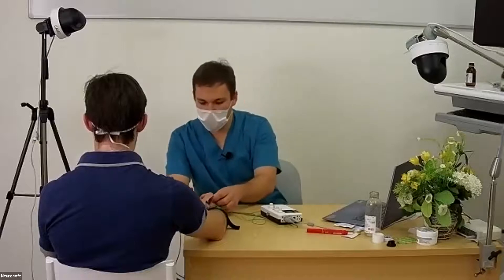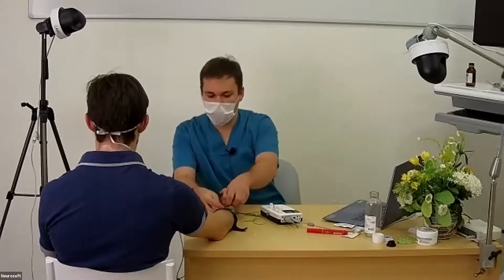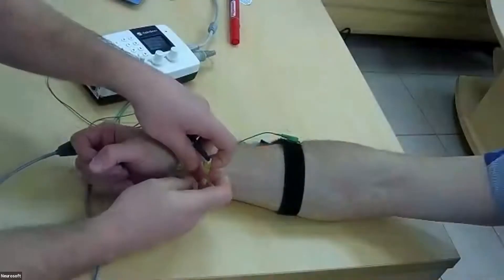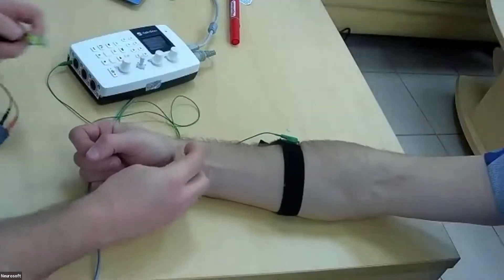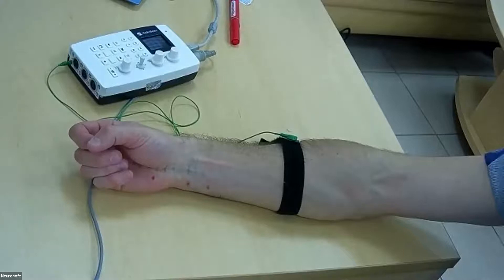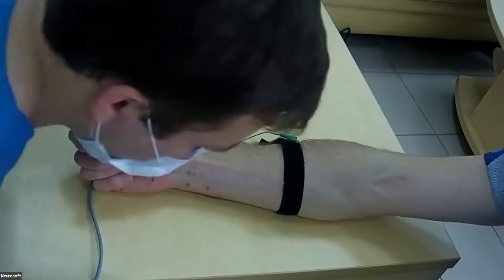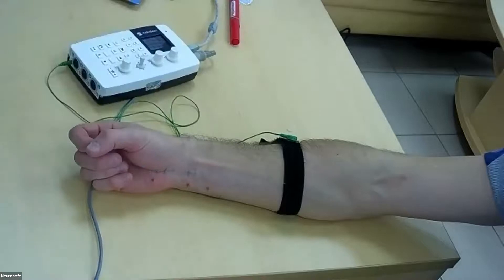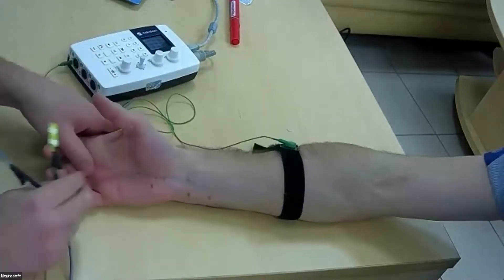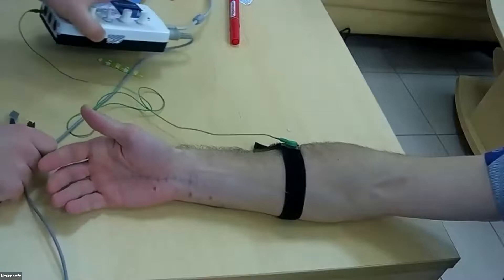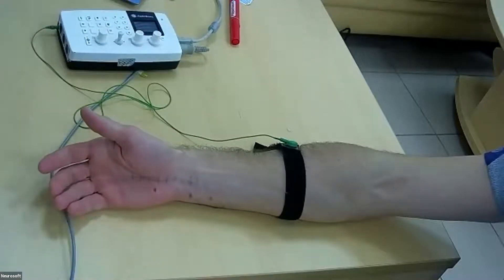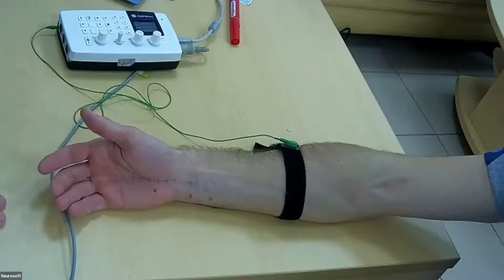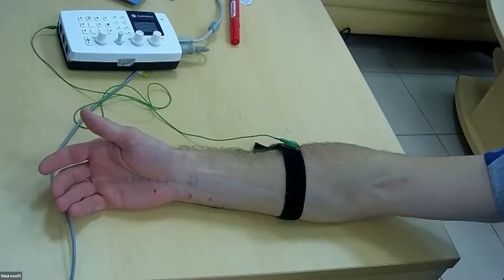Next, we will show inching methods. It will be sensory and partly motor inching. Inching studies investigate short distances of the peripheral nerve to localize more accurate points of different problems, mostly with different local neuropathy, for example, in carpal or cubital tunnel syndromes.